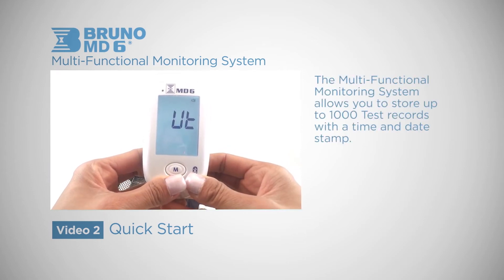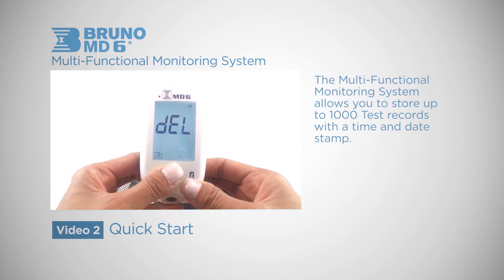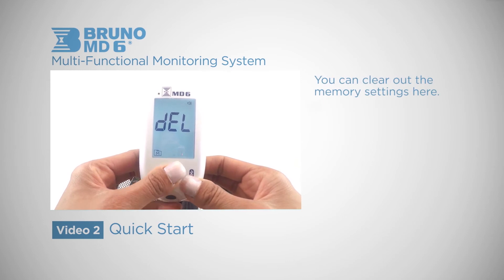The Multifunctional Monitoring System allows you to store up to 1000 test records with a time and date stamp. You can clear out the memory settings here.